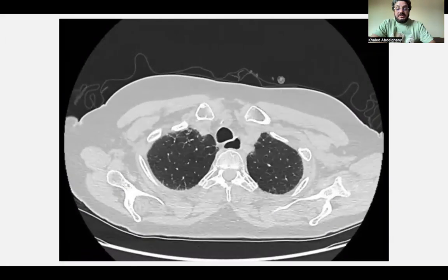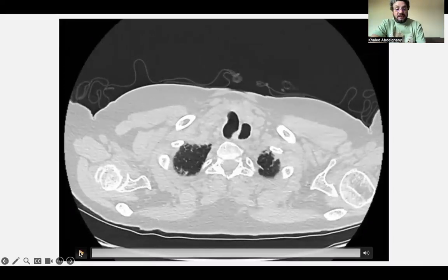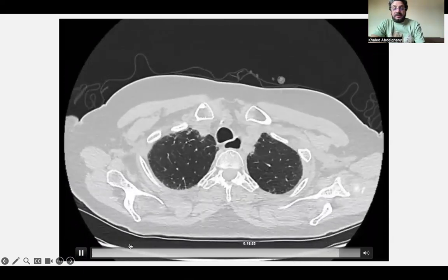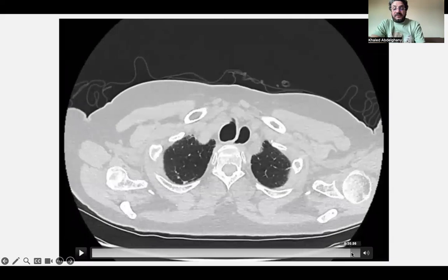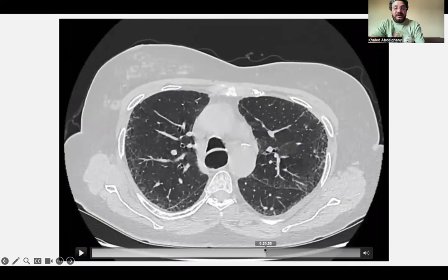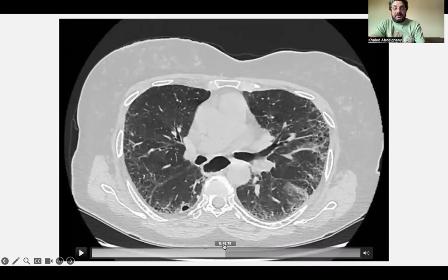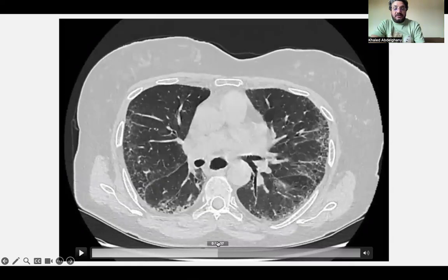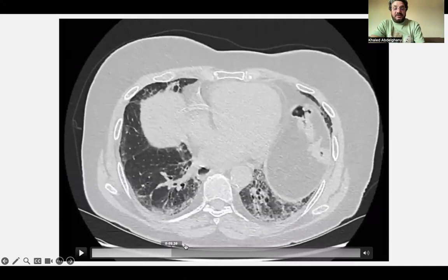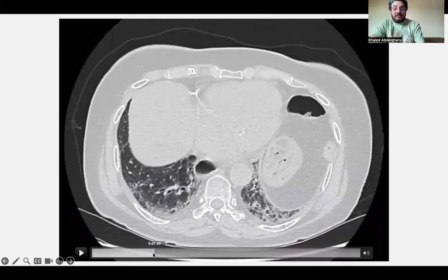As always, the approach is to determine whether findings will be placed in the UIP category or non-UIP. Proceeding from upward downward, we see reticulation and traction bronchiectasis confined to the periphery. No bronchocentricity. Ground glass is confined to the fibrosis, always at the periphery. No bronchocentricity. But no honeycombing. So absence of honeycombing means it is non-typical UIP.